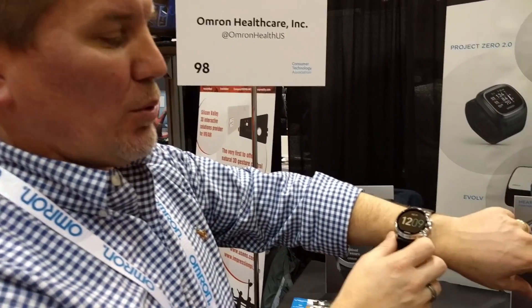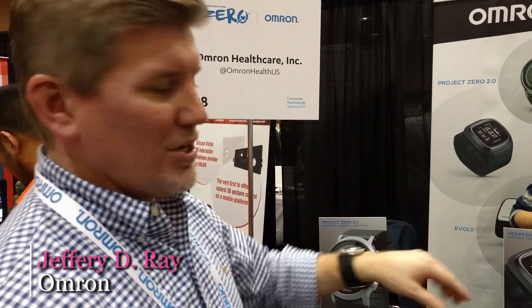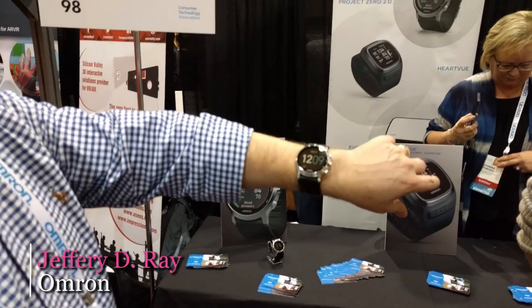It'll be launching this time next year. This is the concept we're showing. We have two other products that we showed last year that we are now actually in the process of launching right now. So our trend is to show a product one year and then launch it at the next CES. Hopefully this product will be launching next year.